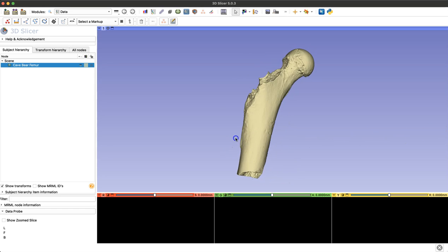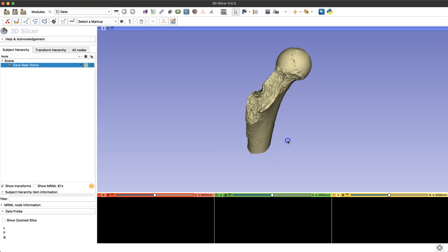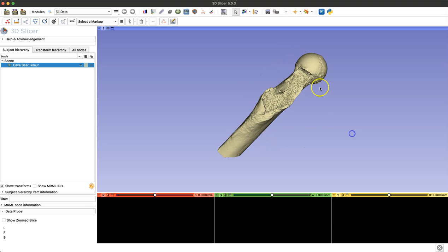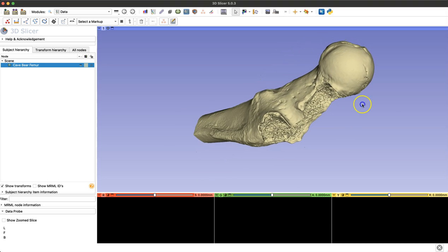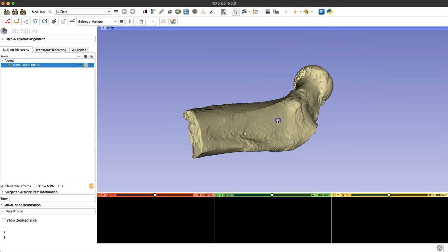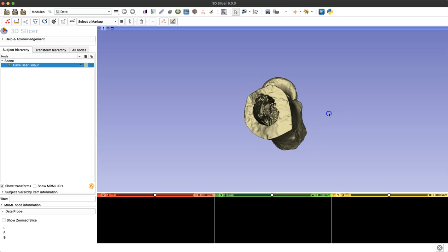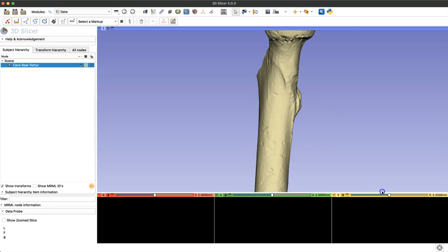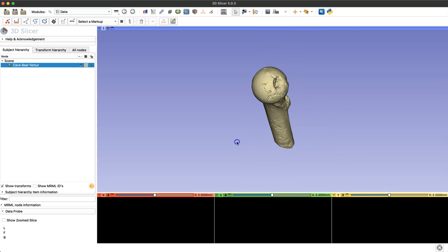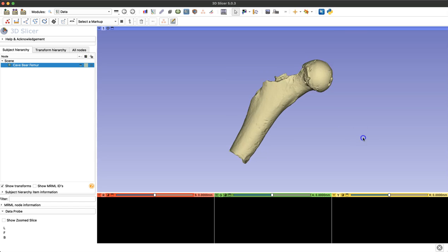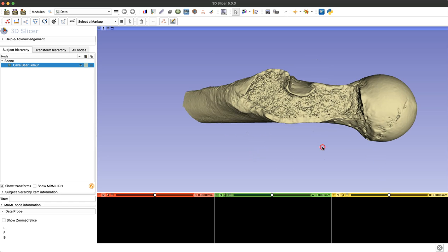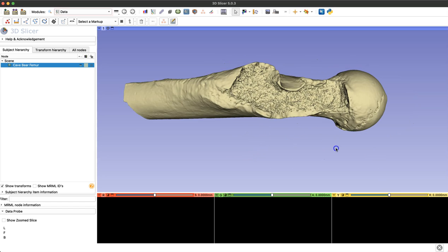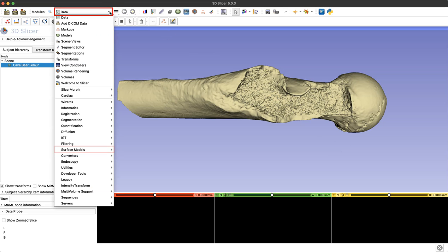If we do a quick examination of this model, we can see it actually has extremely good detail from the CT scan. This is a proximal fragment of a cave bear femur and you can see all that exposed trabeculae and that great detail in the medullary cavity. So our goal for today is to reduce the file size by decimating this model without losing that incredible detail.